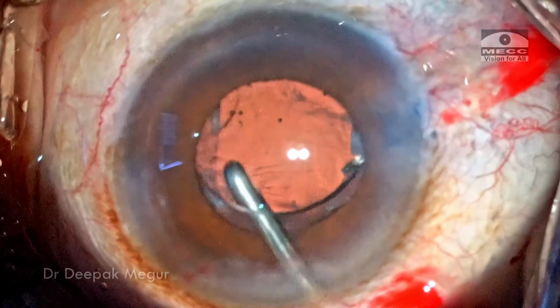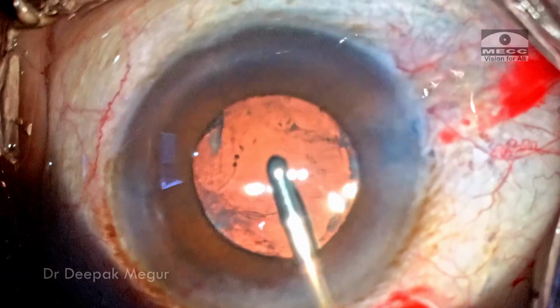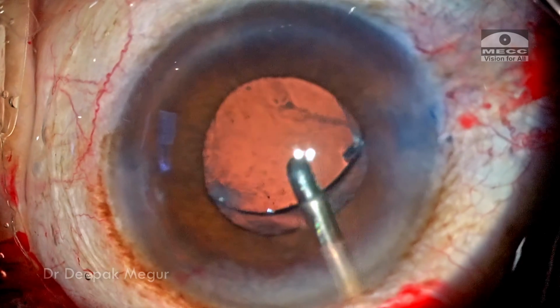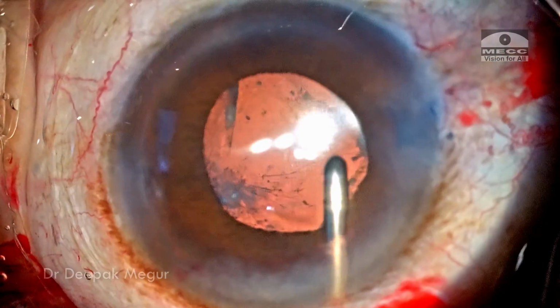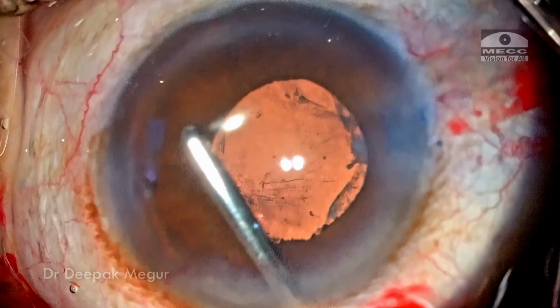Time to remove the OVD. I'm just lifting the intraocular lens and going under it with my irrigation just to flush out all the OVD which is there behind the lens, and also some of it would have gone into the vitreous cavity. Then the OVD in front of the lens is also similarly washed out.